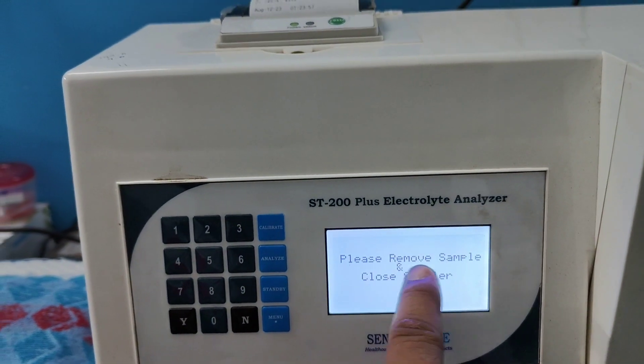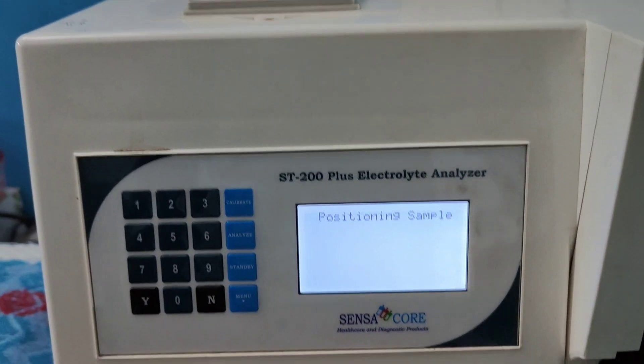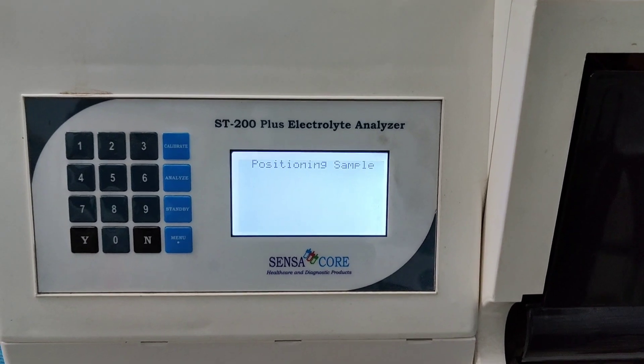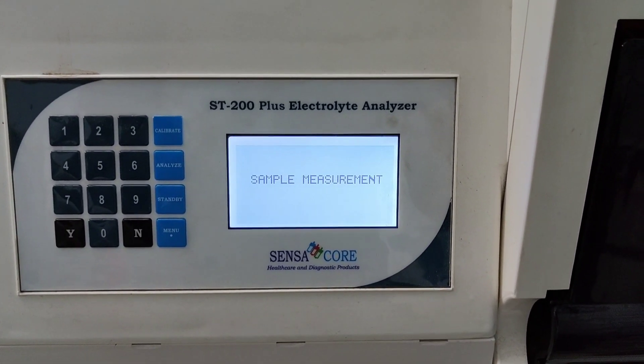Now it is showing. Please remove the sample and close the sampler. Sample measurement is in process.